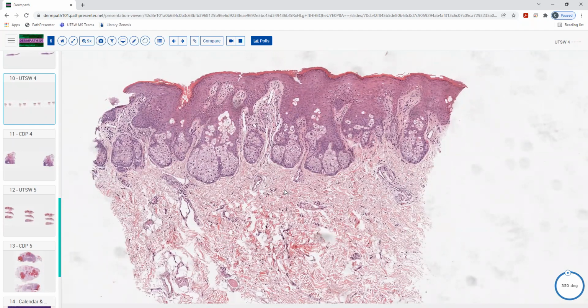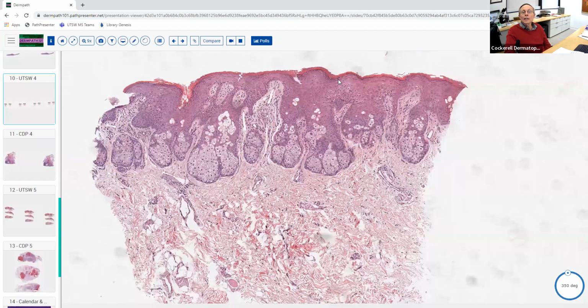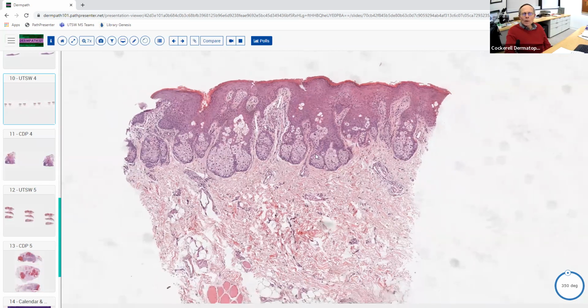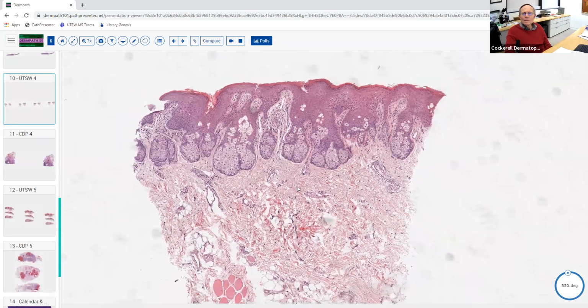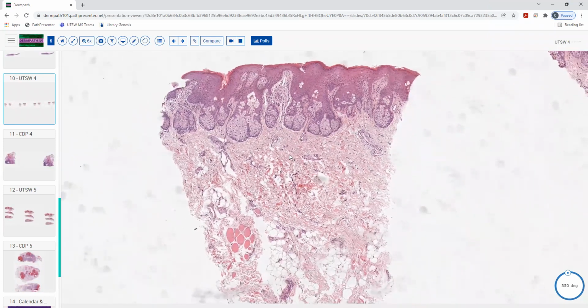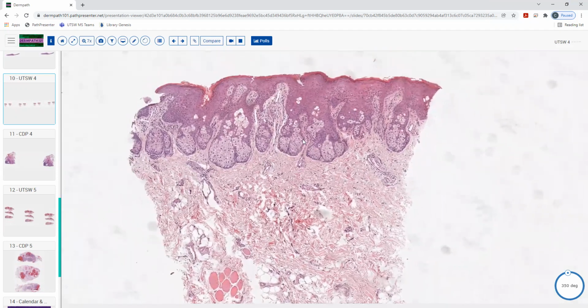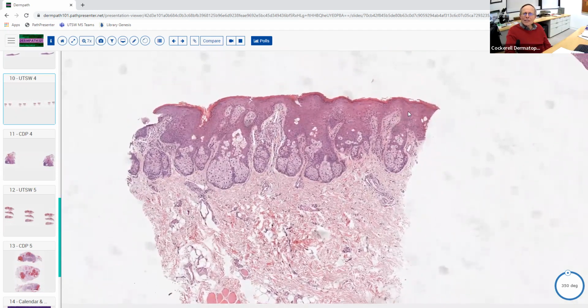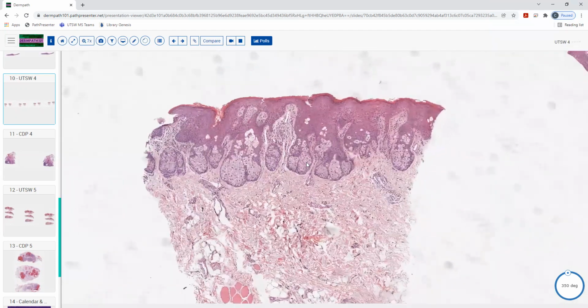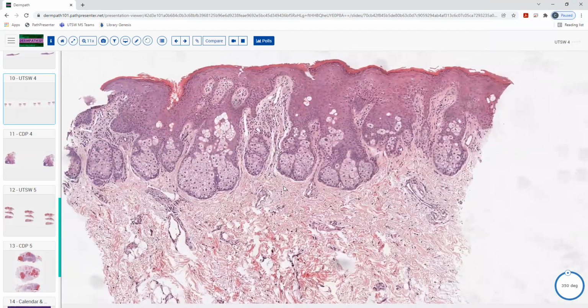I'm seeing a little bit of maybe acanthosis of the. I agree. I think so. And it looks like it's probably been rubbed a little bit. Yeah, like lichen simplex. Any idea what part of the body you're on? Like maybe eyelid, or it'd be pretty thick for eyelid. It's probably, I don't know. I'm just thinking what's going to have muscle that close, unless it's.